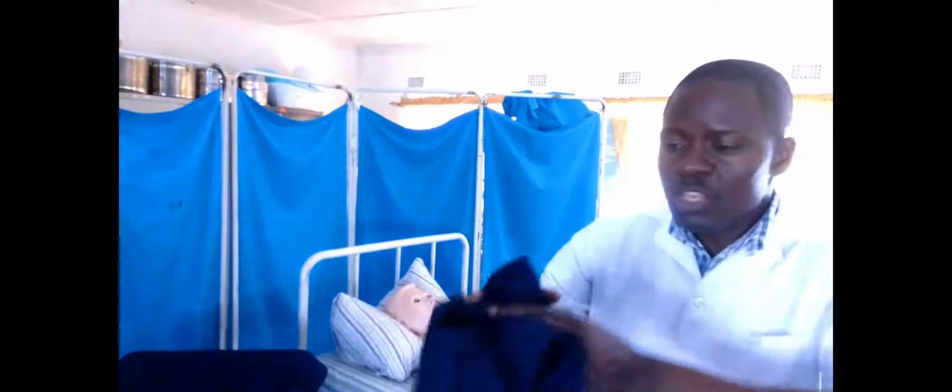Now it comes to this part of throwing. Students will throw just on the floor, but the boys there, just ensure that you fold it like that, then you discard. At this moment, after drying, I have to don gloves. So you open that.